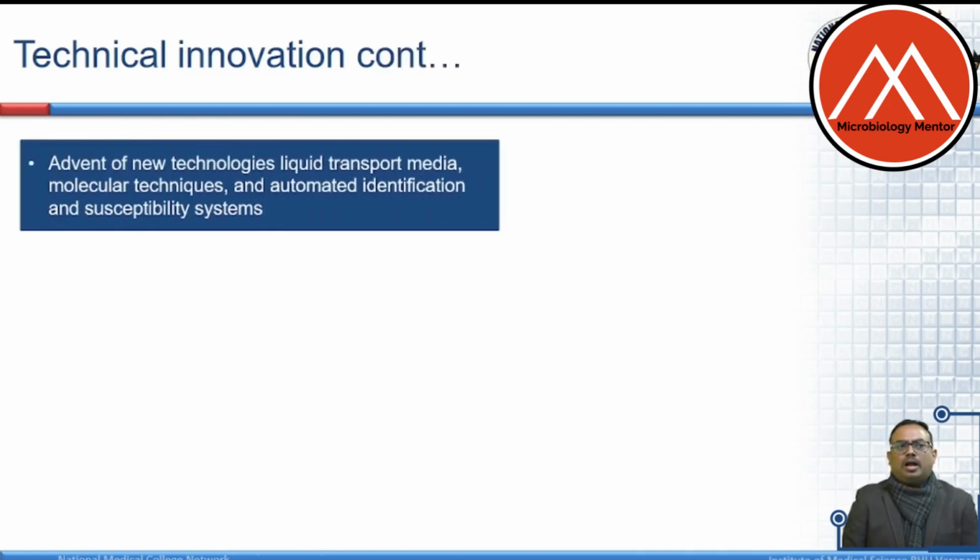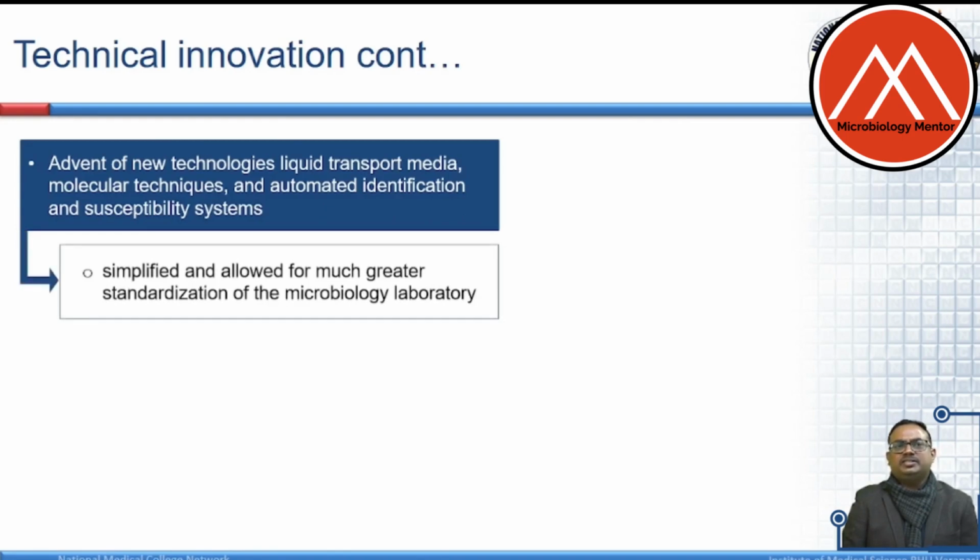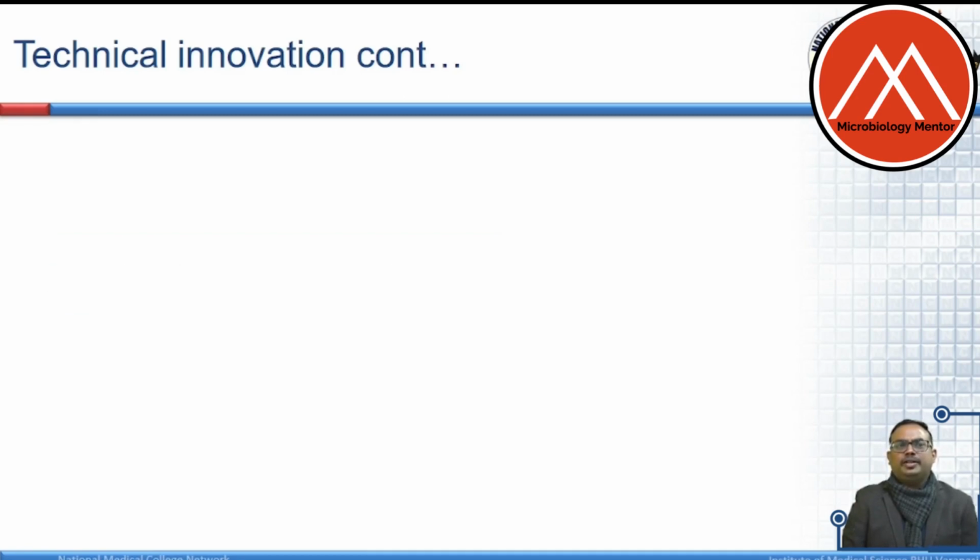Now, other new techniques like liquid transport media, molecular techniques, and automated identification and susceptibility testing system have also simplified and allowed for greater standardization of the microbiology laboratory.